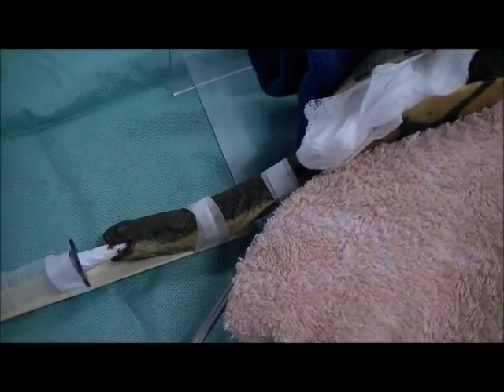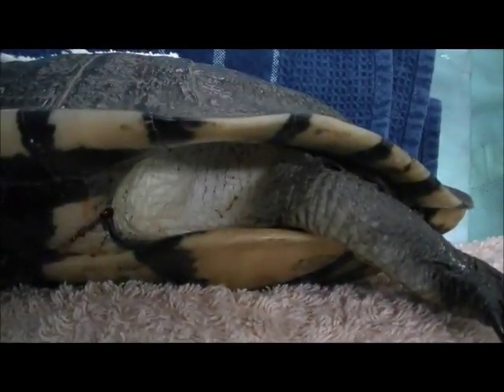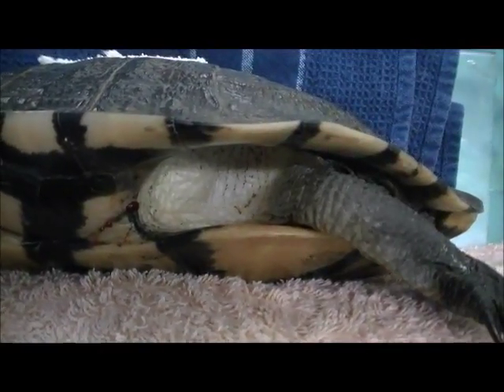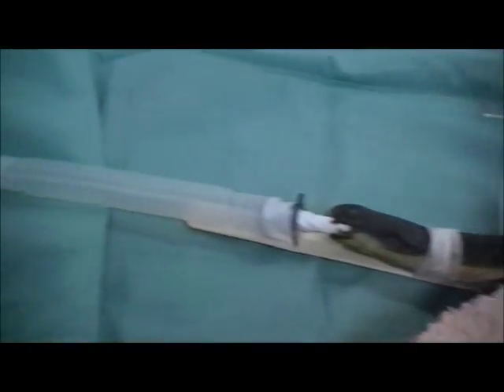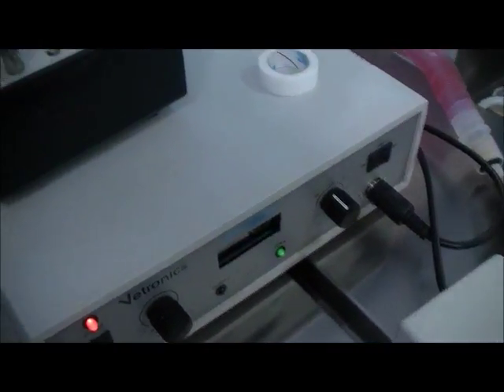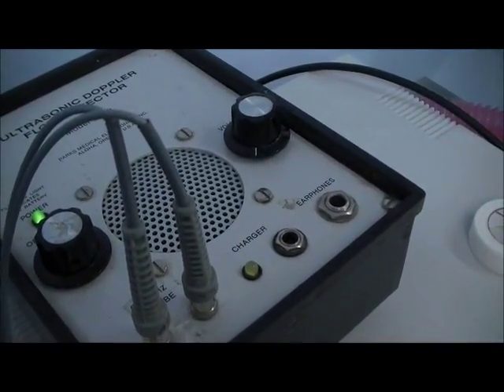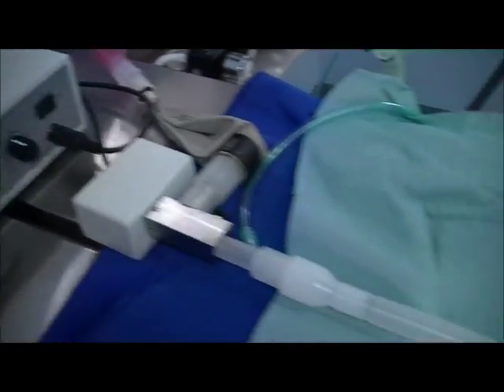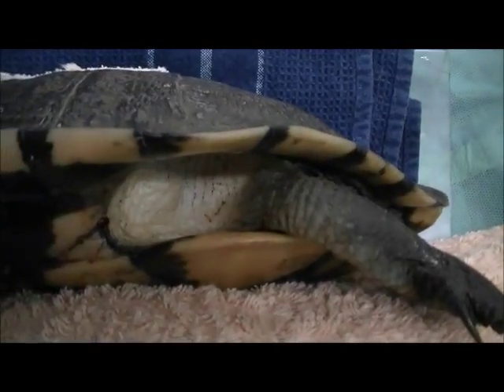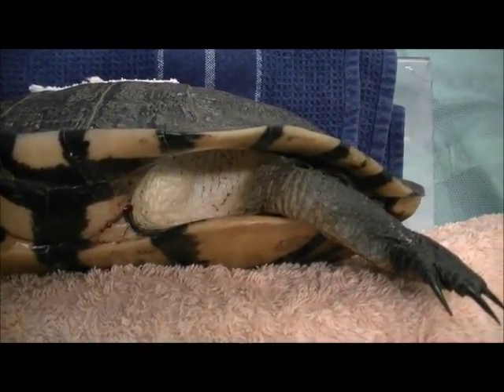So we've got this turtle anaesthetized now, and we've got her positioned here laying on her side, because we're going to make the incision just in front of her rear hind leg — it's called the pre-femoral fossa. She's hooked up to the anaesthetic machine with a ventilator breathing for her. We're going to prep her up for surgery, and we're hoping the eggs are going to fit through that gap. We might have to do a little manipulation to get them out, or roll her over and take eggs from the other side too.